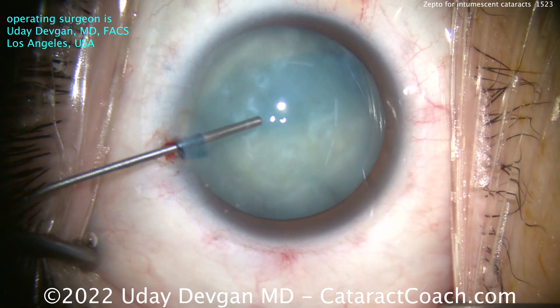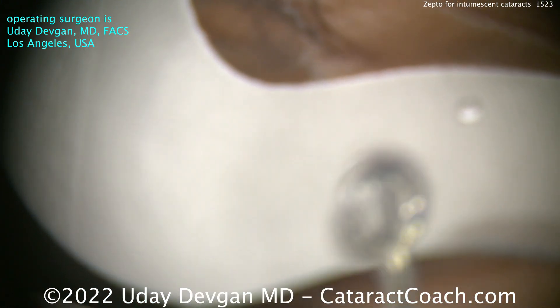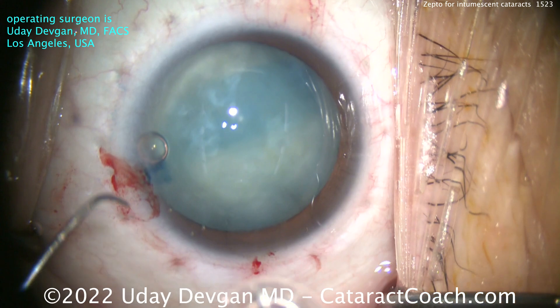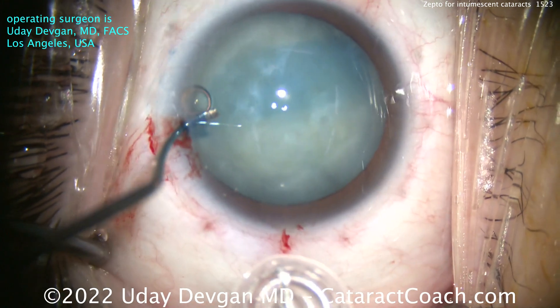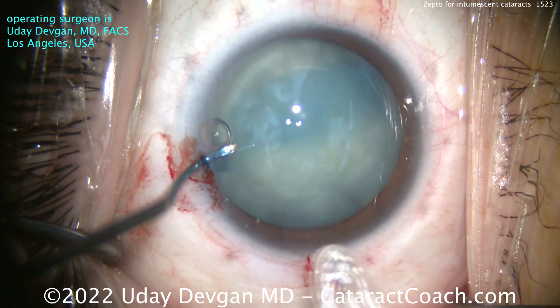Liquefied lens material, lens cortex everywhere. There's the device. You can see it's a round ring, 5.2 millimeters in diameter with a suction cup. As we place it in the eye, it actually can collapse on itself. The ring is made of nitinol — nickel-titanium alloy — so we can collapse that ring to fit through our standard 2-point-something millimeter phaco incision.